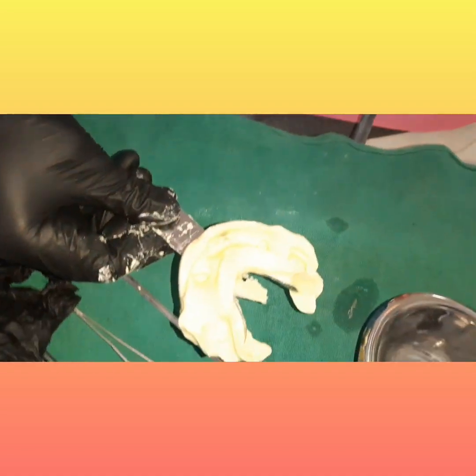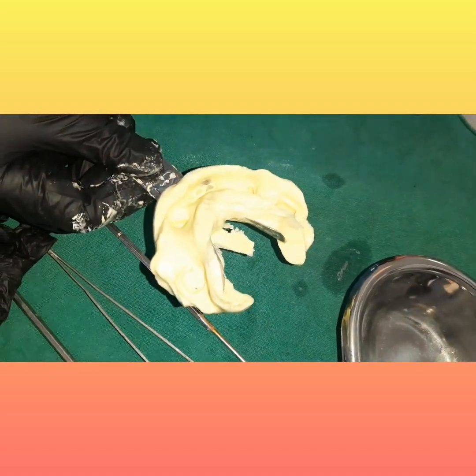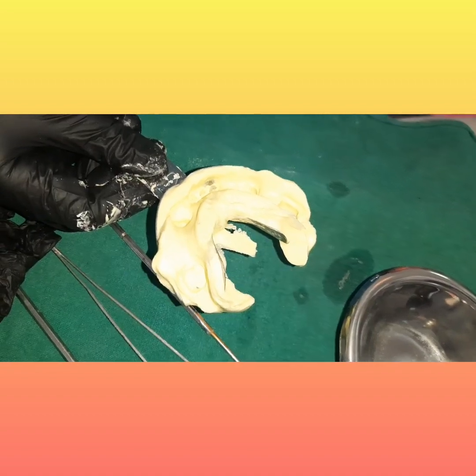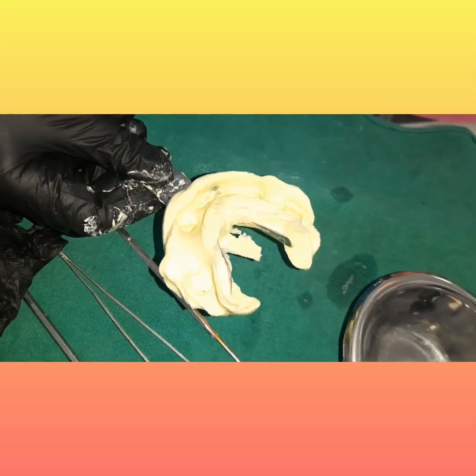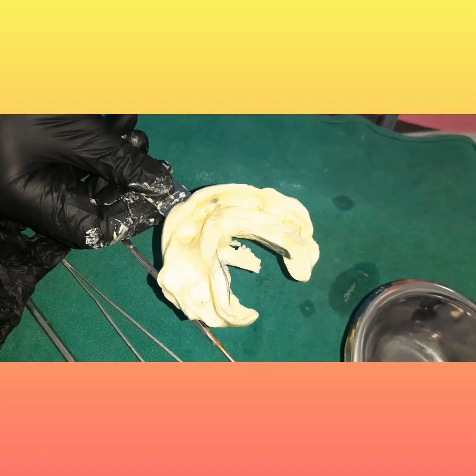This is the lower impression, as you can see. Wash the impression, and then it is ready to be poured with your gypsum product.